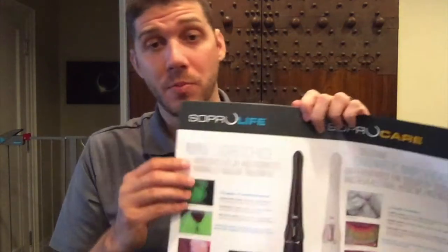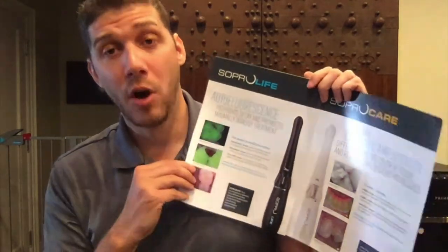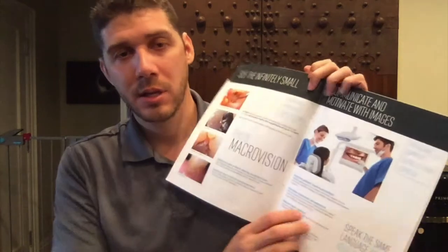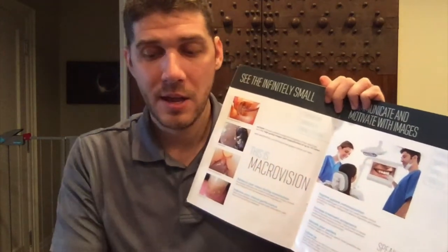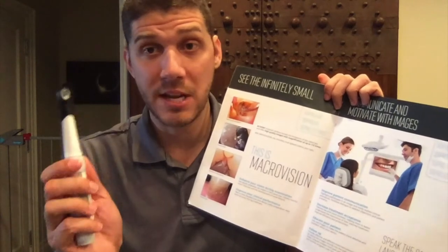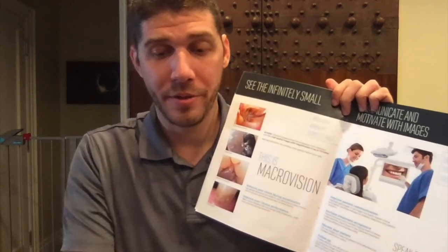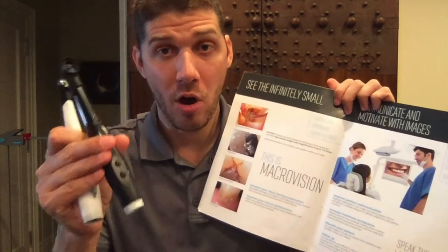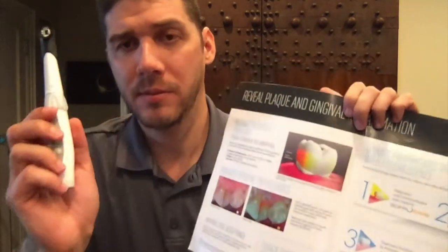Another thing to note: these are diagnostic cameras, but they also have all the features of the other cameras, such as macro vision and the ability to take standard intraoral images. So it's really a two-in-one — an intraoral camera and a diagnostic camera. Both the SOPRO Care and SOPRO Life offer these features, so they're fantastic cameras.